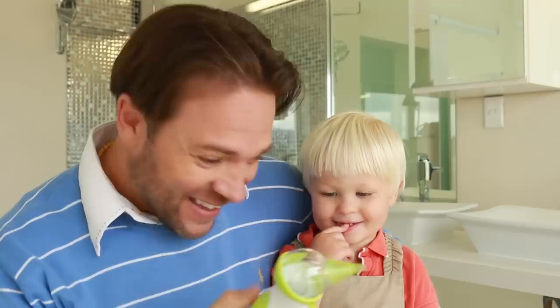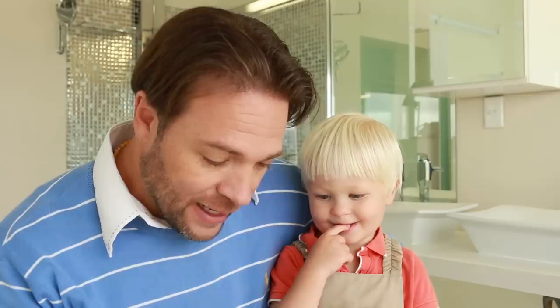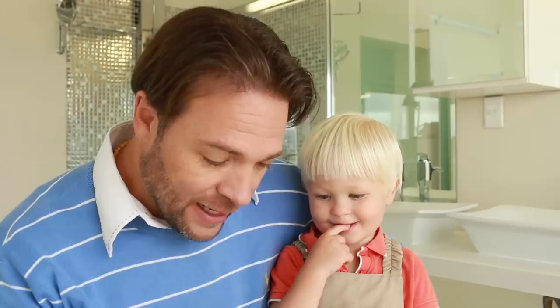My little son Jacques has had a cold the last few days and I have been using the Nosyboo Go and it is working super well. Jacques, here's the penguin — should we put it on? Let's suck our noses, okay?